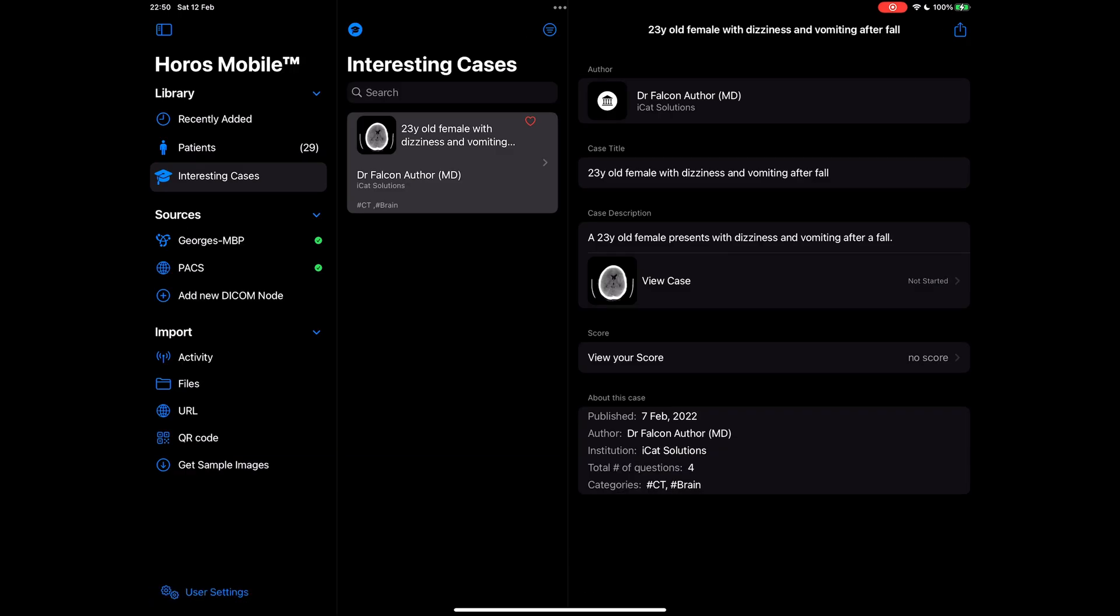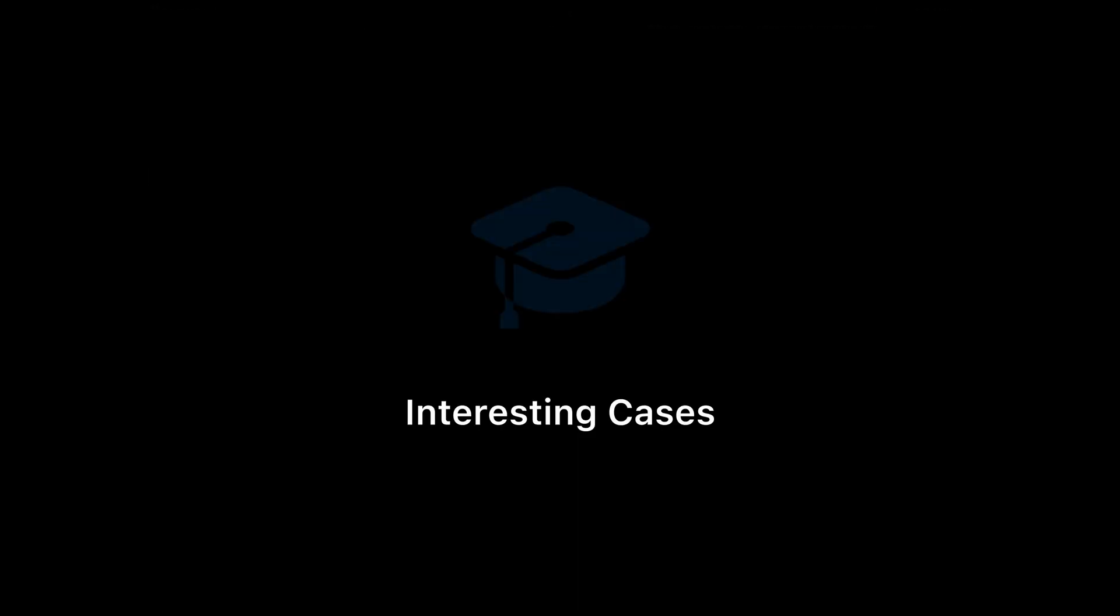So this concludes our introduction to our newest features. Interesting Cases is the most convenient way to learn radiology points, practice new cases and quiz yourselves. Becoming an author and composing cases is a breeze, and couldn't be easier.